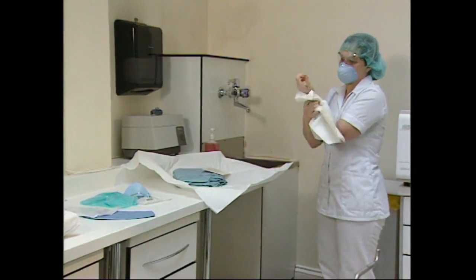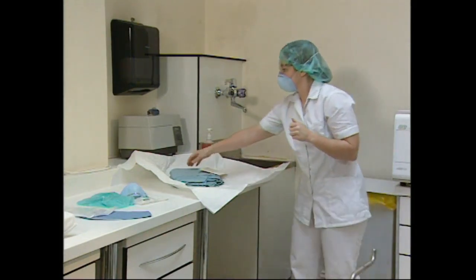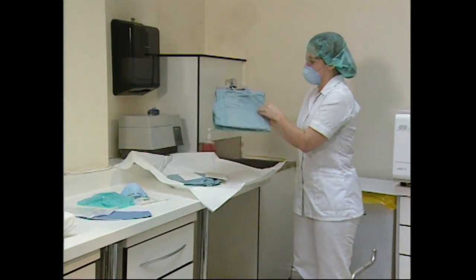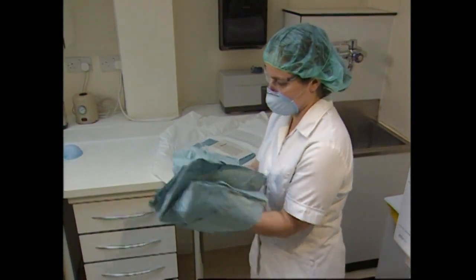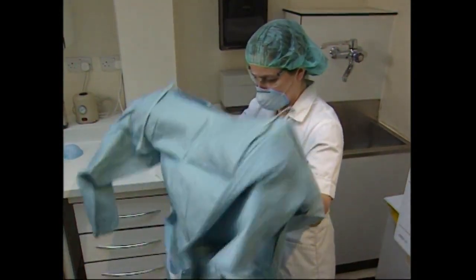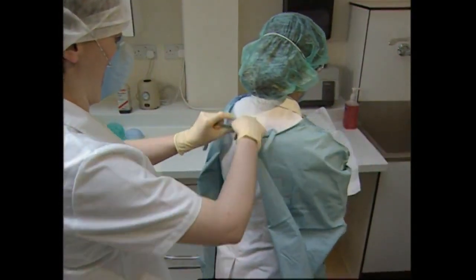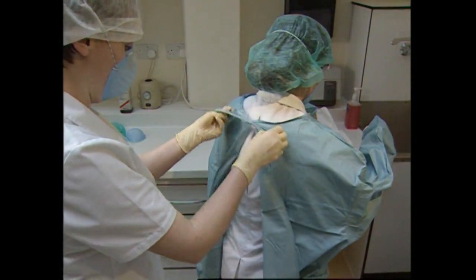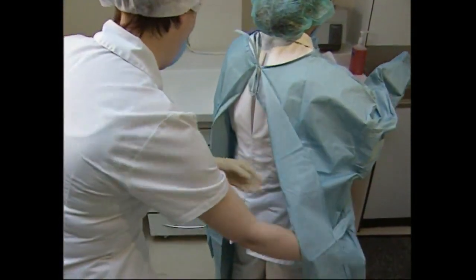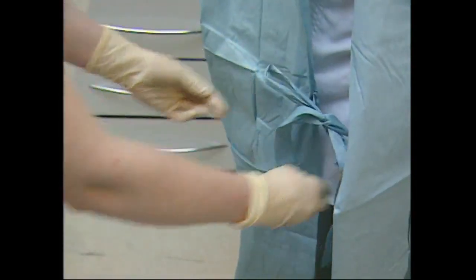This prevents the hands from being contaminated by the elbows. The sterile gown is picked up by the surgical assistant, leaving the second gown untouched and uncontaminated for the surgeon. The gown, which is folded in a specific way, is positioned so the hands can be inserted into the recesses on each side and pushed through to the sleeves, allowing the gown to unfold, making sure that there is no contact with a non-sterile object. The non-sterile roving assistant then secures the preliminary ties of the gown. The surgical assistant will not allow her hands to emerge from the cuffs of the sleeves before the gloving procedure. The aim is to contact the inner portion of the gown only without contaminating the sterile outer surface.